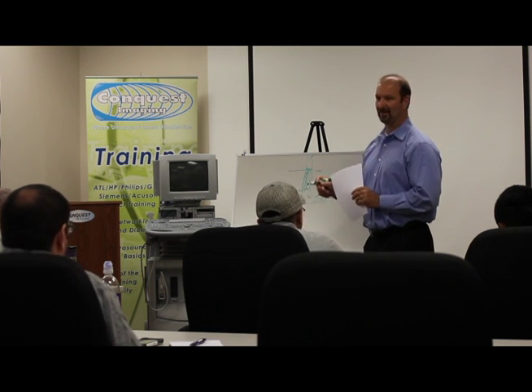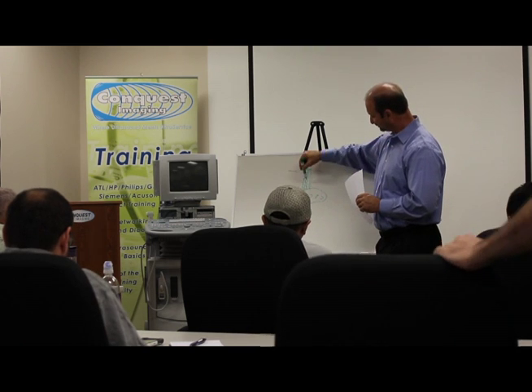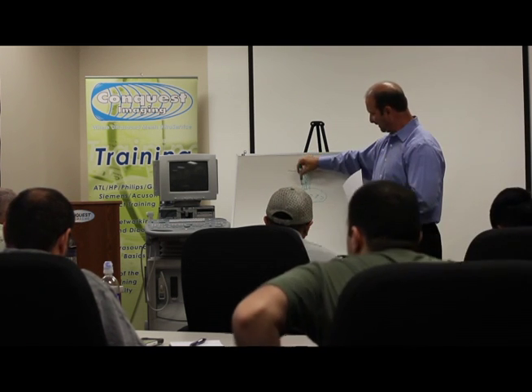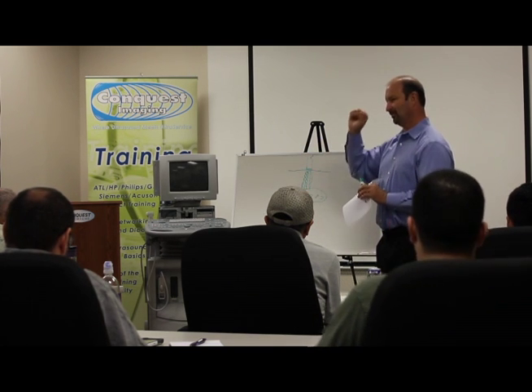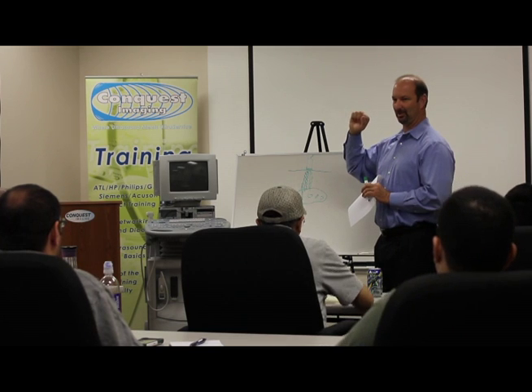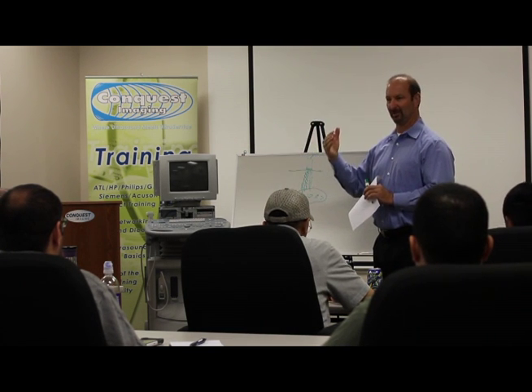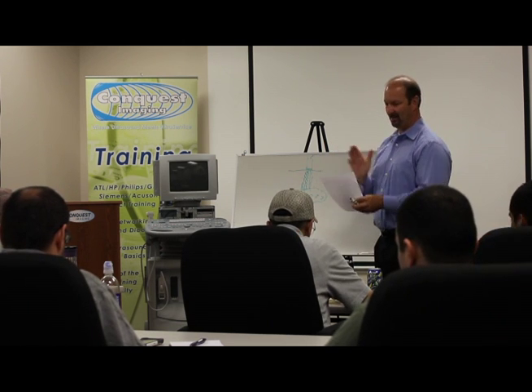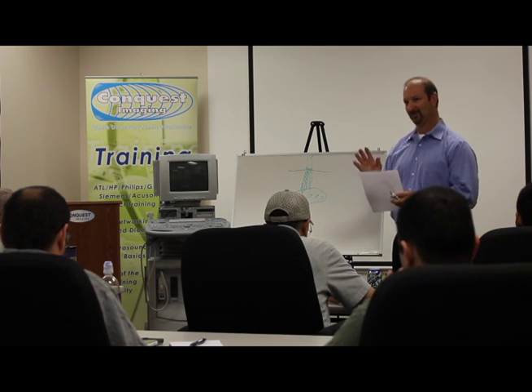We'll talk about compounding and harmonics, and how that differs with those. So you have all these sound waves coming in. They get through the tissue, but every time they hit something, the transducer will pulse, let's say 3 sound waves, boom, boom, and then it'll stop, and then it'll listen for what comes back. And it'll do that a specified number of times, depending on how the machine's set up, and that'll put together one frame.